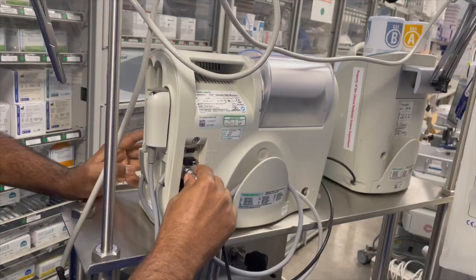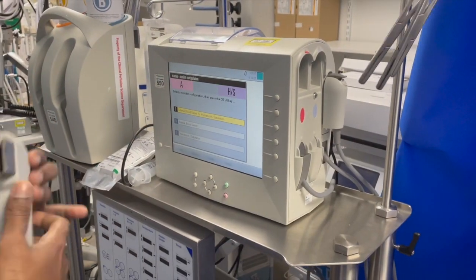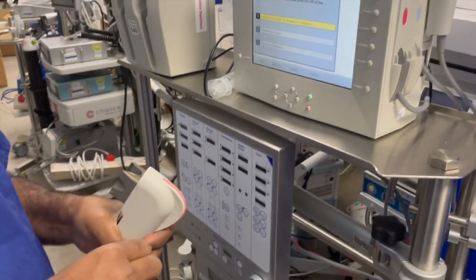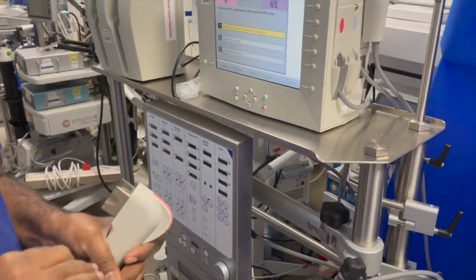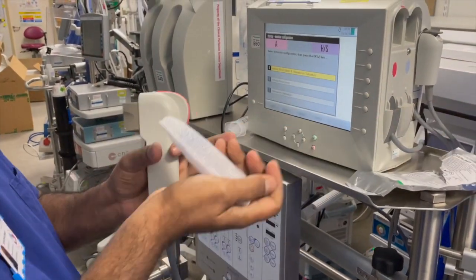The arterial shunt sensor has to be calibrated for every case. To calibrate, connect the calibrator to the monitor. Once connected, the calibrator receives its power from the monitor. Attach the arterial shunt sensor to the arterial blood parameter module.